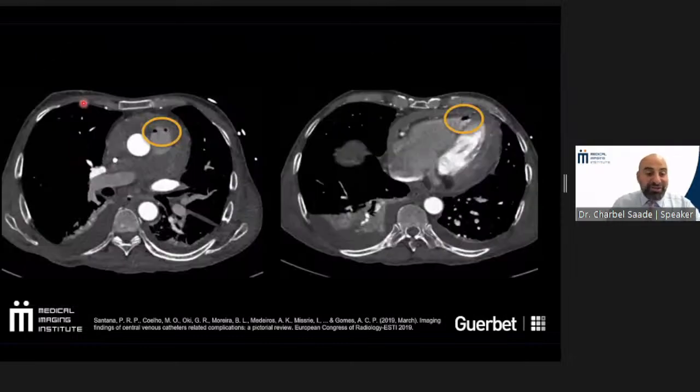And also when you're injecting into central lines, look at this here. You can see the contrast there, which is good, but be careful of air bubbles. Now, what is the problem here? Because while everyone's flushed everything perfectly, there's still air bubbles in the syringes and the lines. That's why it is so important to tilt it down.